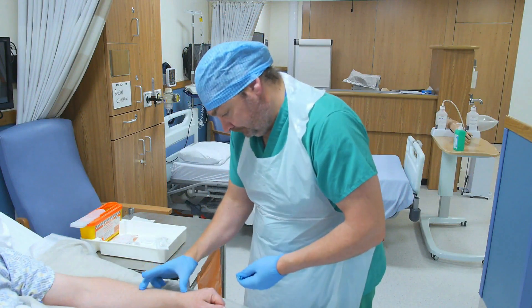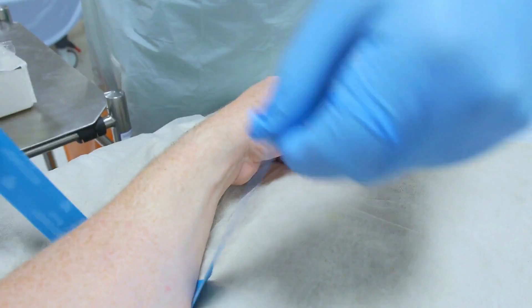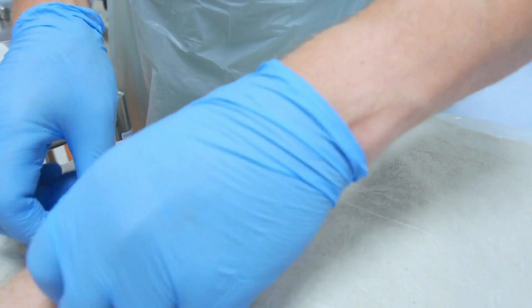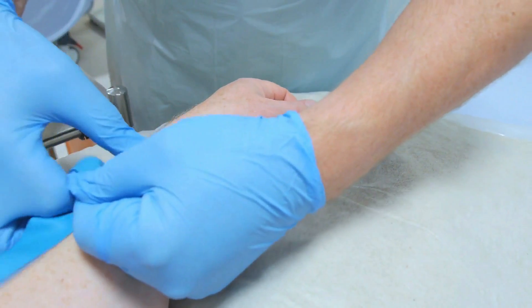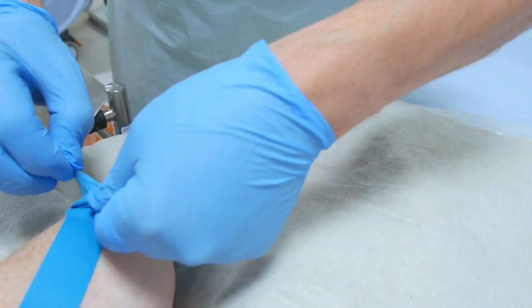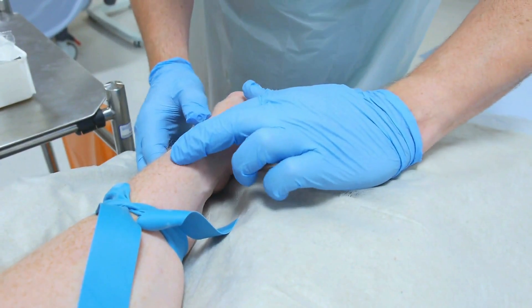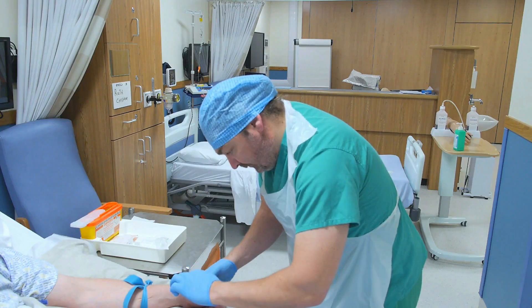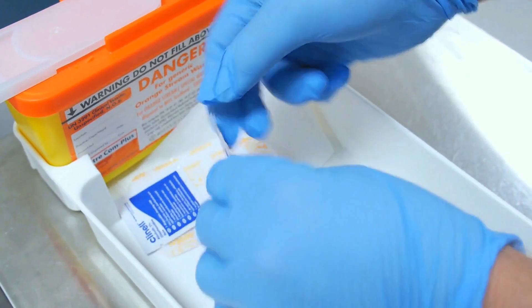Apply a single-use tourniquet approximately 10 centimetres above the intended puncture site. It's important to take time to observe, assess and select a suitable vein. You can ask the patient to clench their hand to further aid venous filling.